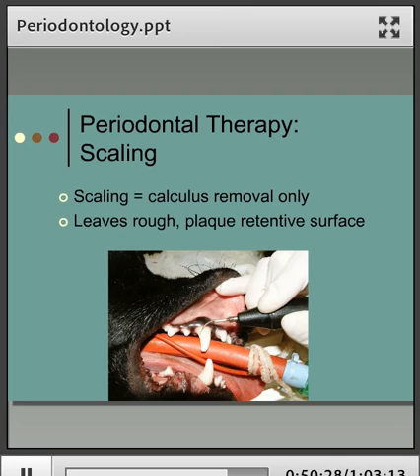There's not really an actual number that's safe or not safe, but I would err on the side of caution, get all of the elements correct, and only spend a couple of seconds on the tooth, and then go to the next one, the next one, the next one, then come back, and again and again. And that way you get everything clean as fast as you can, but also in the safest possible way.